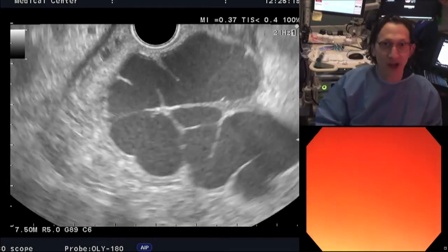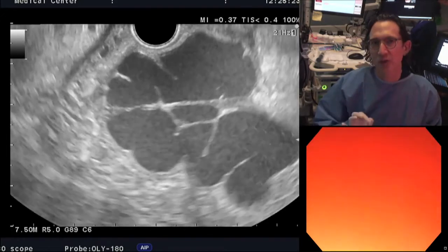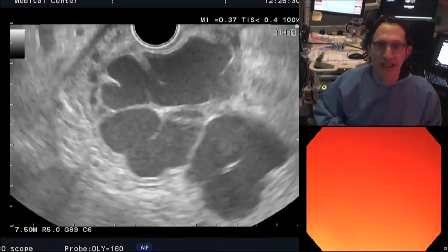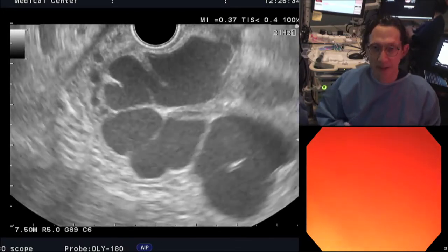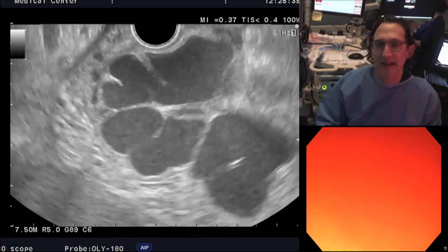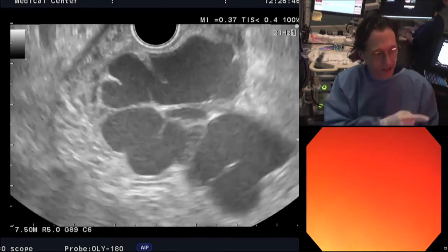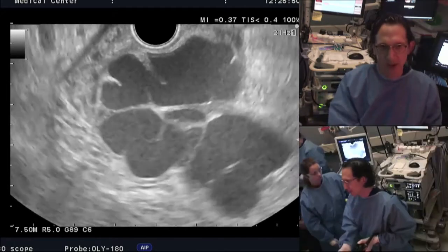Okay, so the stylet is out. It's been primed with saline. And why is that? Because we do not want to inject any air accidentally into the varices once we puncture it. We want to make sure that we don't contaminate it with any air. We should always have fluid in there, whether it be our saline, flush, or blood. All right, so now we're going to bring the thumb screw down. And I don't know whether there's a camera that can show this, but I'm going to advance.